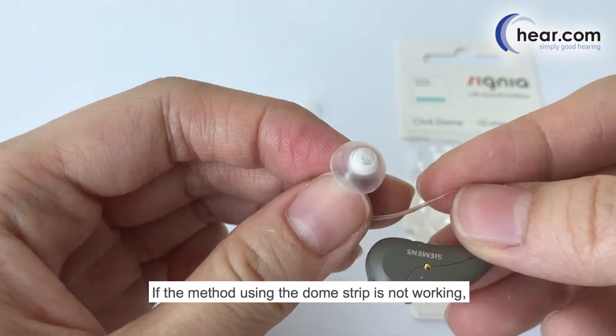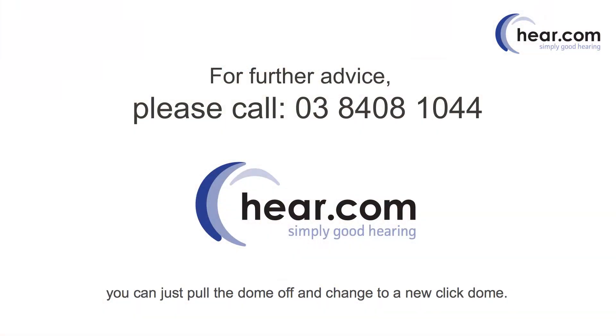If the method using the dome strip is not working, you can just pull the dome off and change to a new click dome.